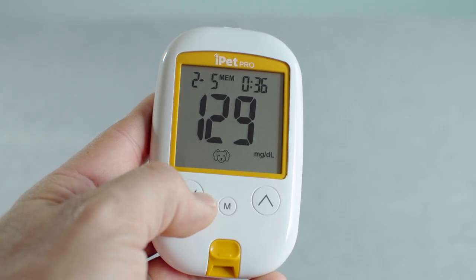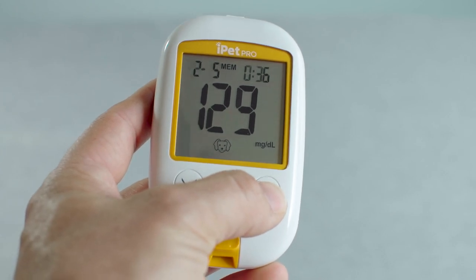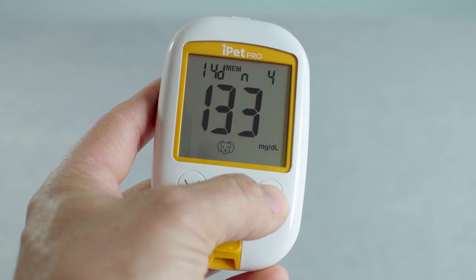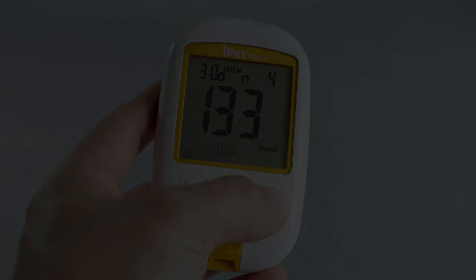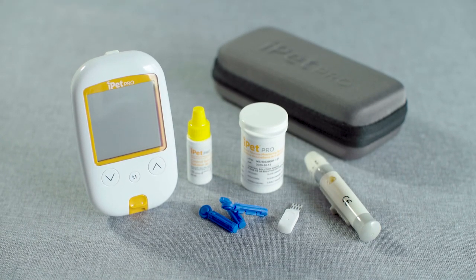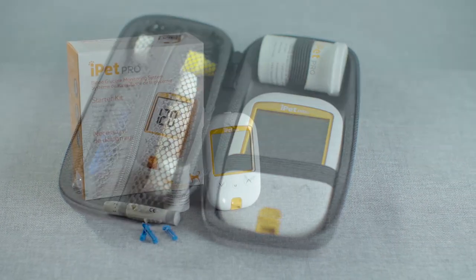The iPet Pro Meter stores the 500 most recent blood glucose results and also provides 7, 14, and 30-day averages. Please refer to the user guide for more details. With the iPet Pro and your veterinarian's help, you can provide the best possible care with quick, accurate, and consistent results to help manage your pet's diabetes.